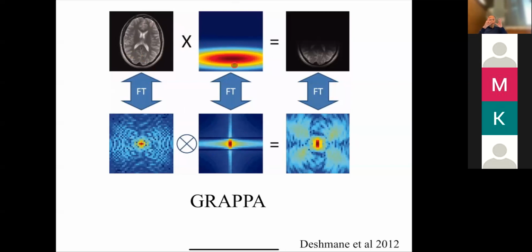And the smaller I make that sensitivity pattern, the broader that kernel is going to get, right? Now I take this and convolve these together, and I end up with a blurred out version of my original Fourier transform. What that means is points in K-space are no longer independent, right? Our assumption was we have to acquire every point in K-space because it's giving us unique information, right? But once I've done this blurring, guess what?